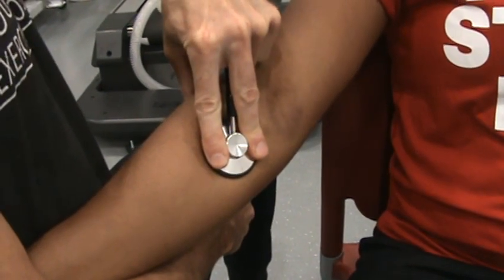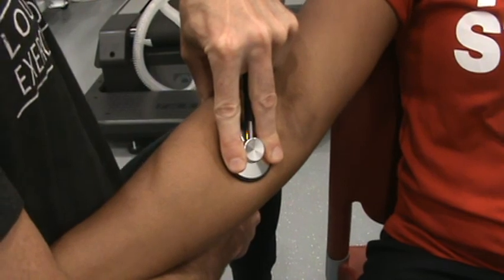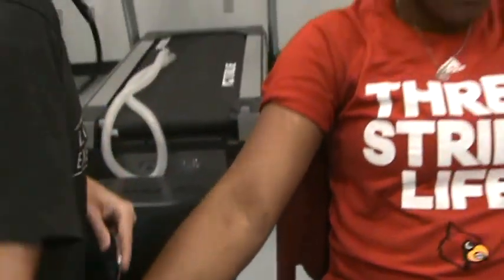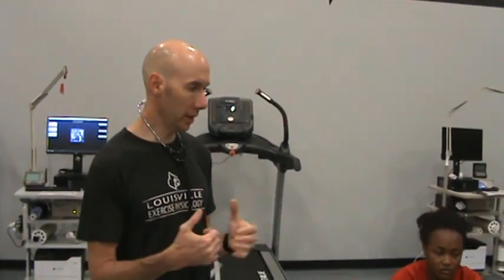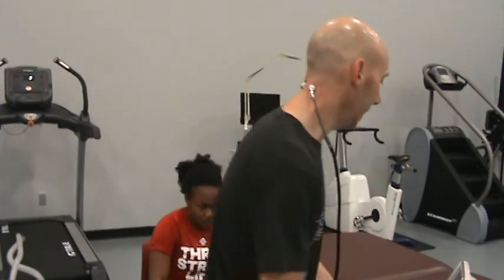I'm applying light pressure, but not too much, to keep that nice and level and flat against the skin. That'll just make it easier to hear, okay? Hearing it is one of the biggest challenges. You want to give yourself every advantage possible, so that's one thing you can do to make sure you can hear it adequately. Okay? All right, so one more thing we'll do is the standing pressures now.